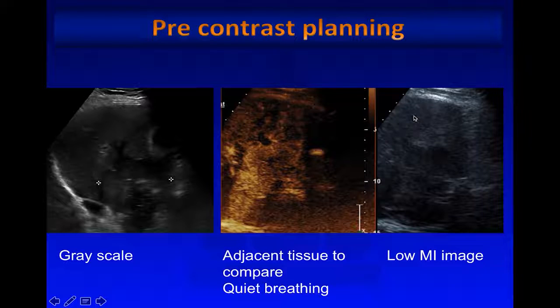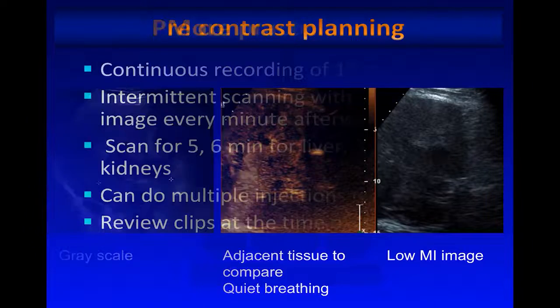You also want to keep in mind that the exam is going to last several minutes, so you put the patient in a position where the patient is comfortable and you can see the lesion and the organ in and out when the patient is breathing. So in most cases, a longitudinal approach is better because you can see the lesion, you can see the organ, and you can see it as the patient is breathing. And we recommend that the patient has quiet breathing. So pre-contrast planning is important to optimize your examination.